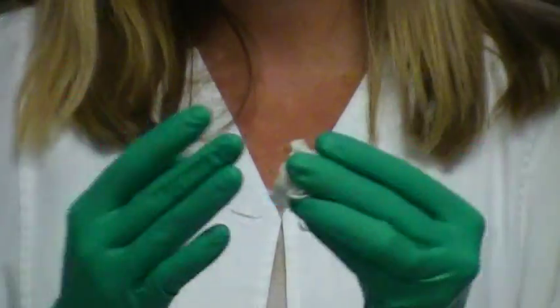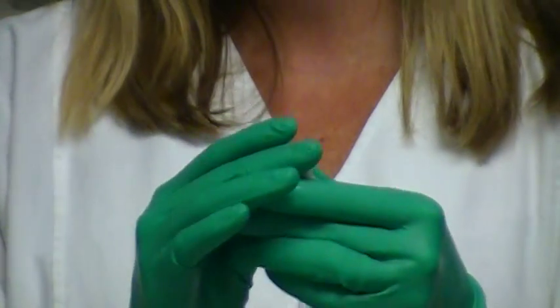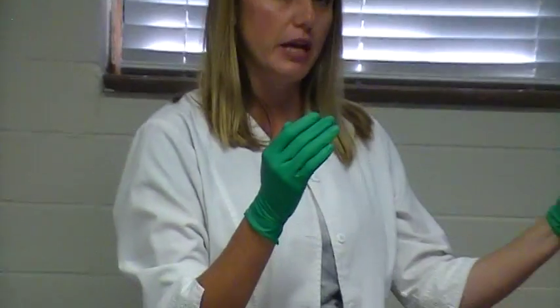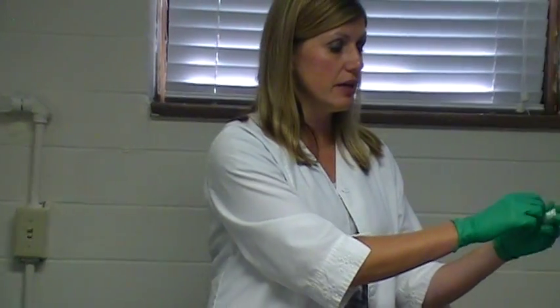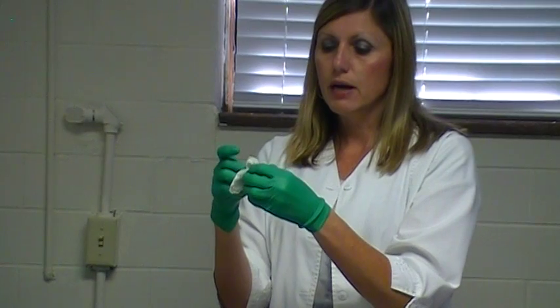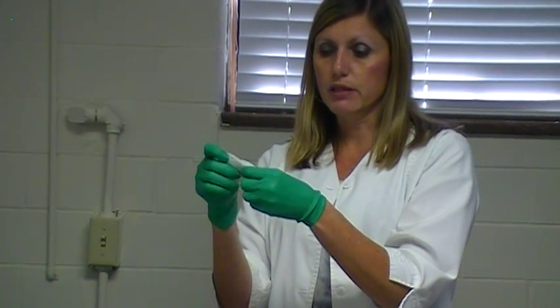Okay, the first thing I want to do is pick up my wet gauze. Now, if it is too wet, like let's say you accidentally poured too much solution on it, then you can take it and wring it out over your trash can. Do not drop your hands below your waist though, because remember that would be breaking your sterile technique. Keep your hands above your waist level. I didn't pour very much on there, so there was nothing to wring out.